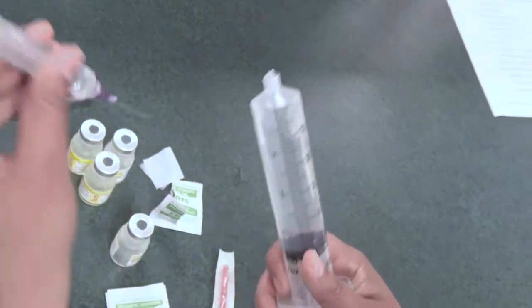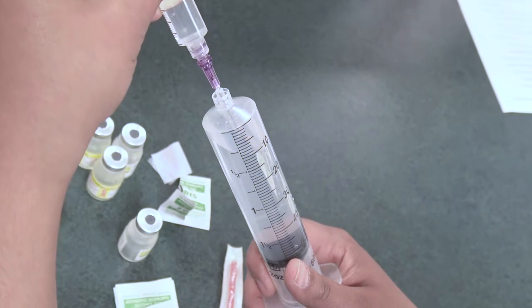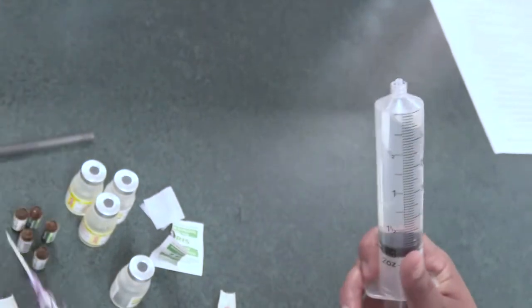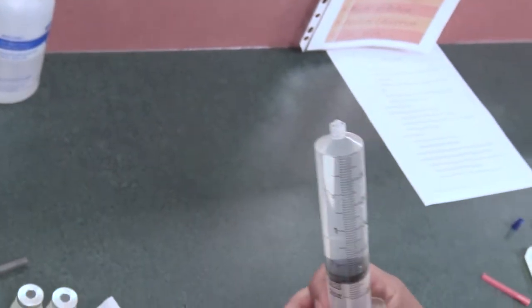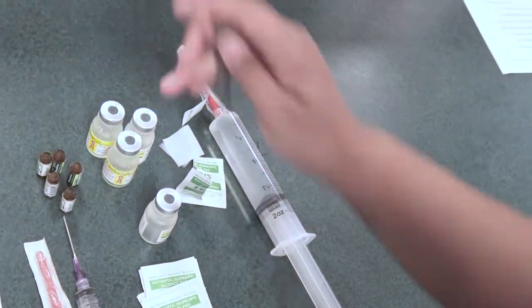This way the medication goes in and we have the right concentration. Okay, now that this is finished, I'm going to put the cap on, and now I'm going to write out my label.